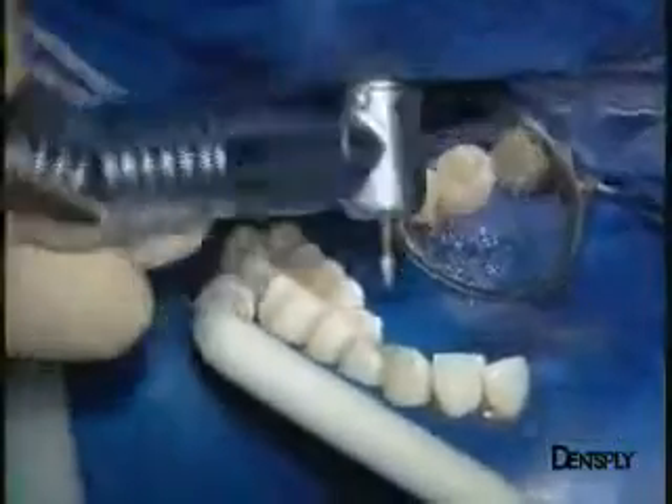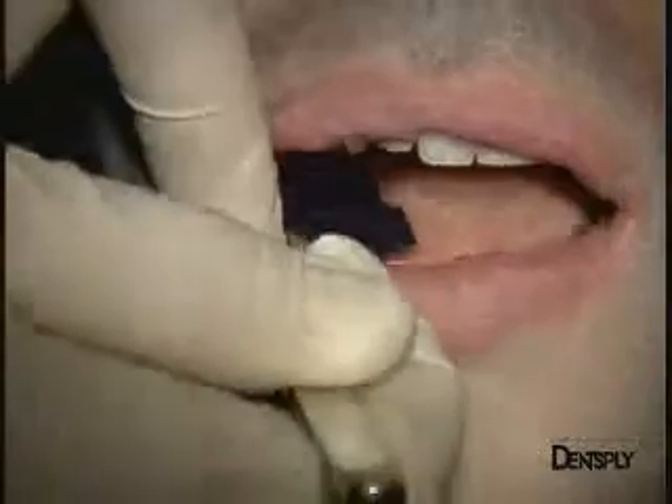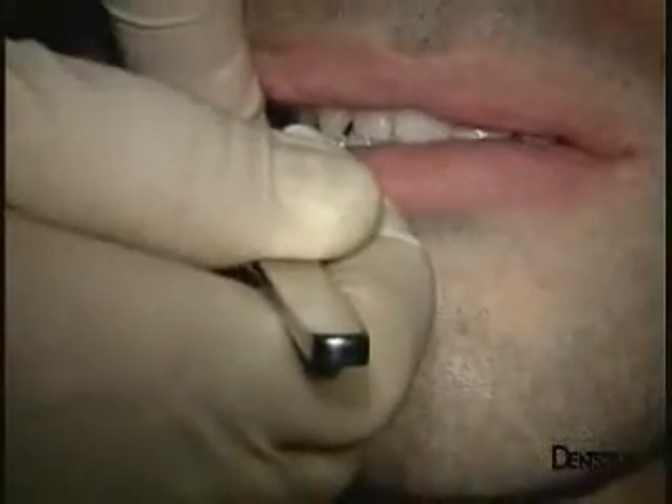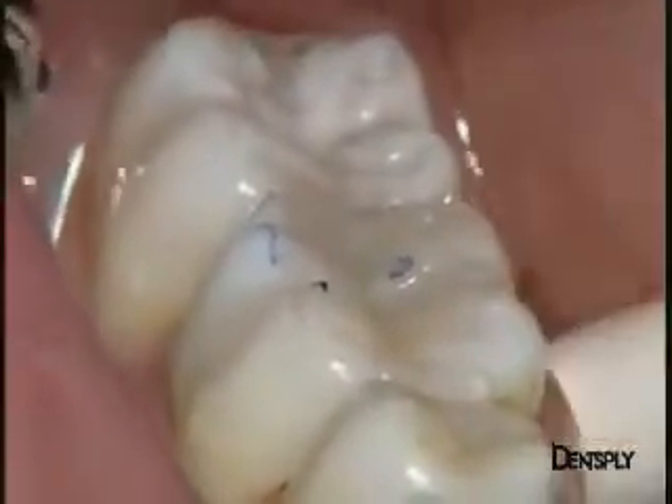A few finishing touches need to be applied, and the bite made regular. This bite is positioned at the bulbs, which have been deliberately exaggerated. At this stage, a very precise adjustment of the contact points to the antagonistic tooth can be obtained.